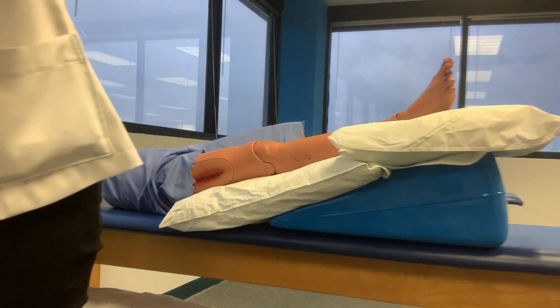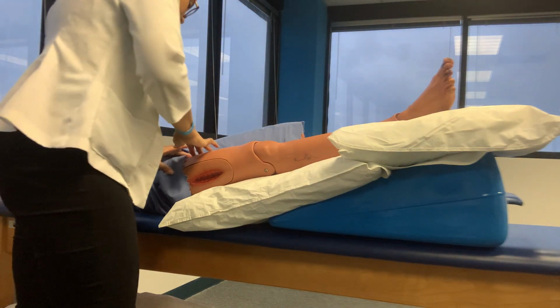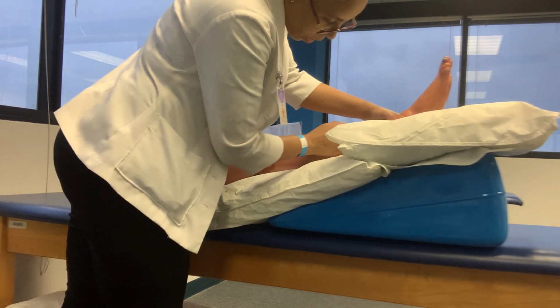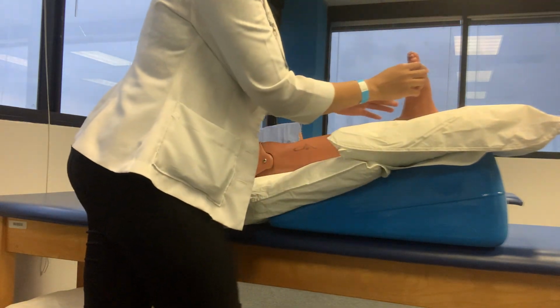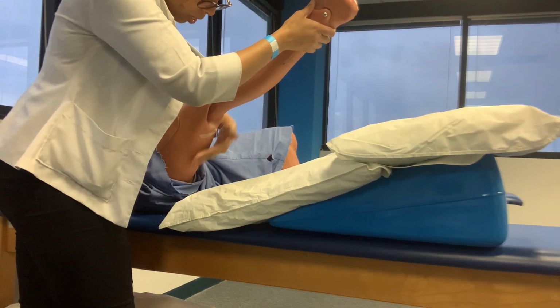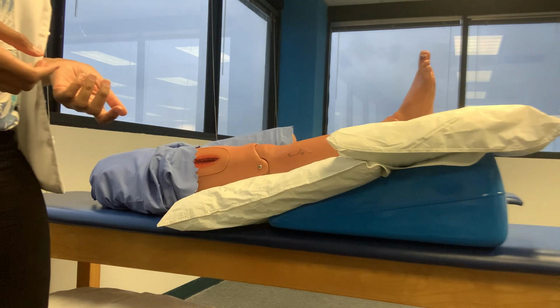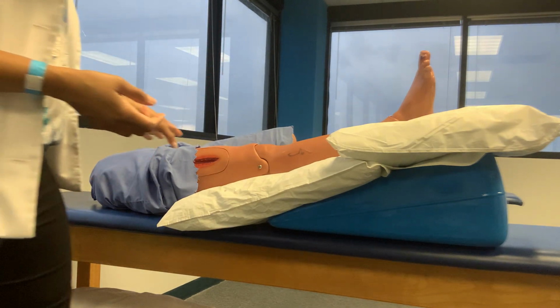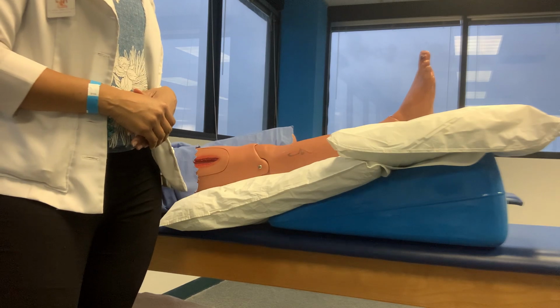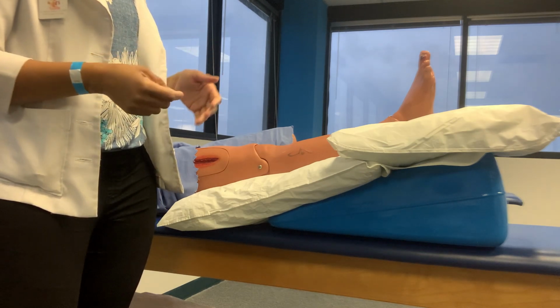All right, so once the sleeve and the stockinette are removed, then I have to do my third and final skin inspection. So again, it's going to be a detailed skin inspection, proximal, distal, anterior, lateral, checking the bottom of the foot, checking between the toes, also checking posterior to see. And then we do our girth measurements at the end as well. You just verbalize that. We won't make you take them again. But then we would also do girth measurements at the end to make sure that you saw some changes with their limb girth with the treatment.